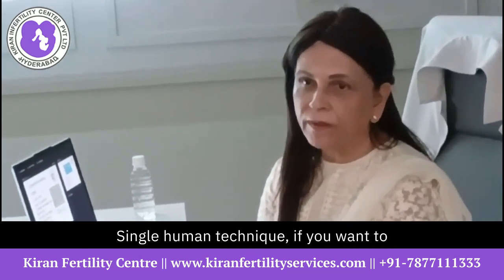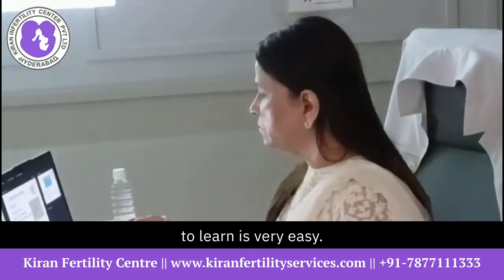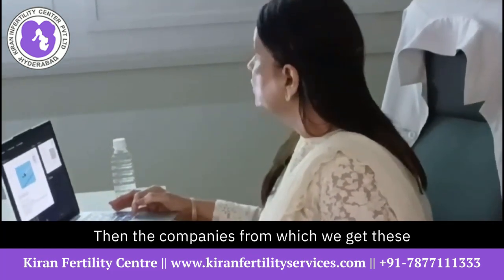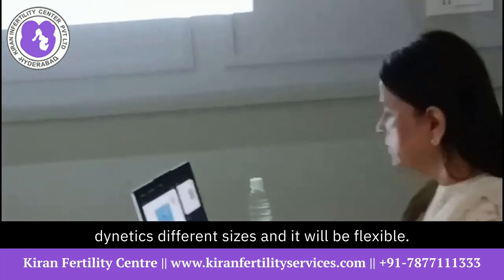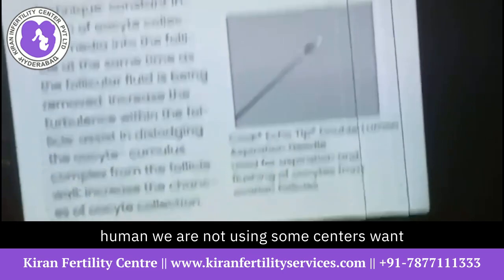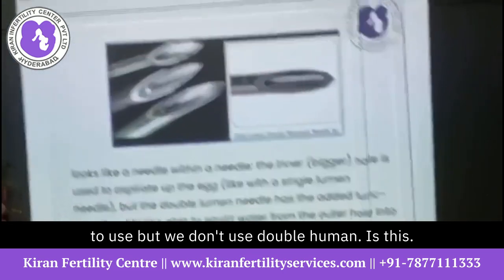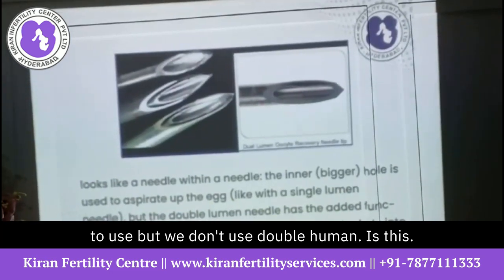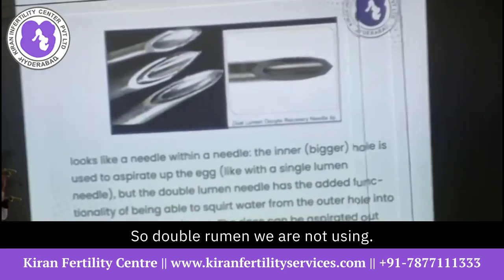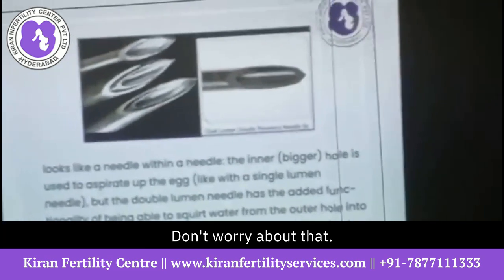Single lumen technique, if you want to learn, it's very easy. Then the company from which we get it is Gynetics, different sizes, and it will be a bit flexible. And double lumen, as I told you, we are not using. Some centers want to use it, but we don't use it. Double lumen is this. Can you see the double lumen? Yes. So double lumen we are not using. Don't worry about that.